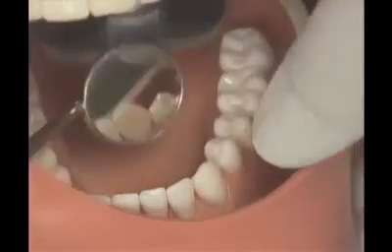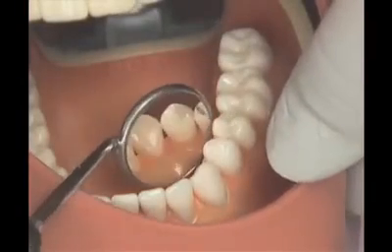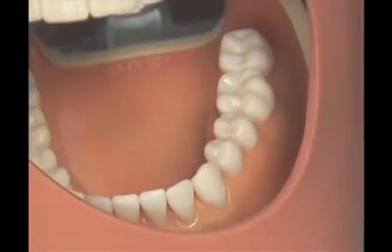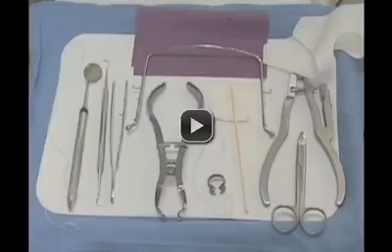Inspect the dam to ensure that the entire pattern of the torn septa of the dental dam has been removed. If a fragment of the dental dam is missing, use dental floss to check the corresponding interproximal area of the oral cavity.